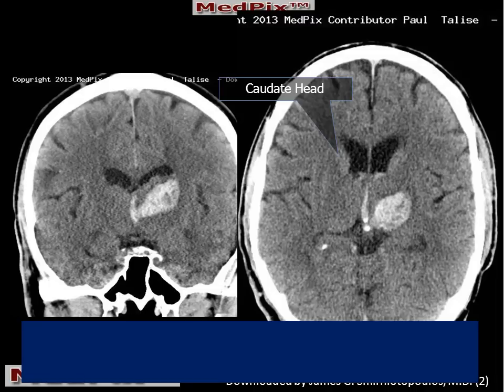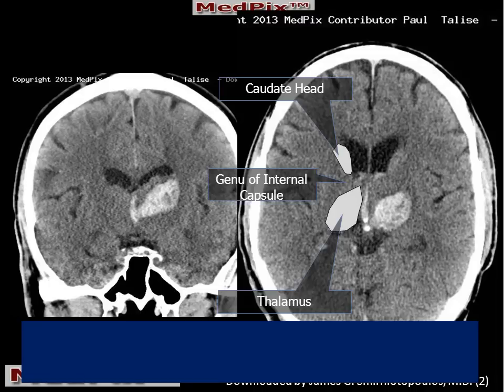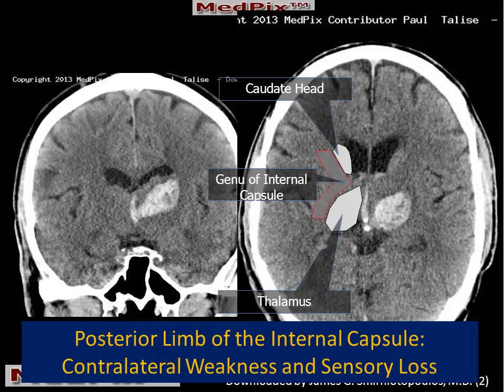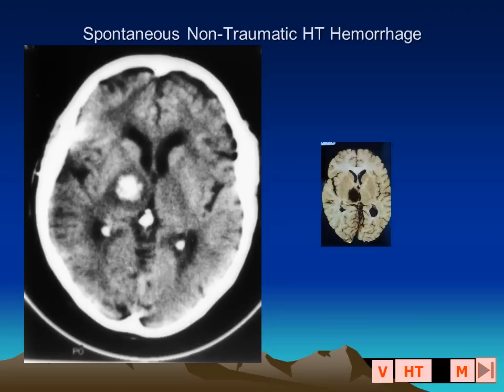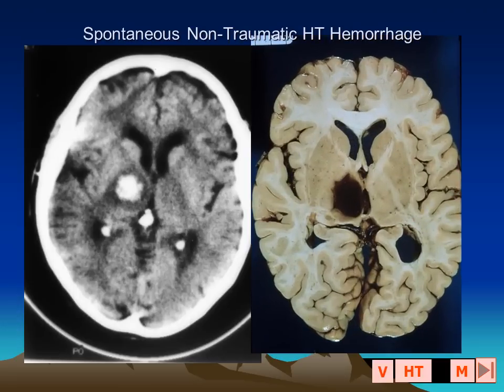Our patient had a classic presentation of a deep gray matter hemorrhage that also affected the posterior limb of the internal capsule as a result of hypertension. Here are a pair of images in another patient who has a deep gray matter and internal capsule hemorrhage, also involving the thalamus.